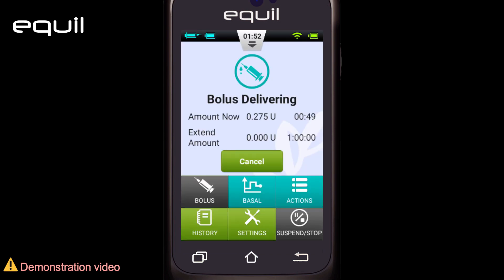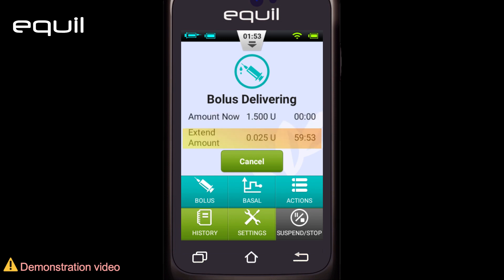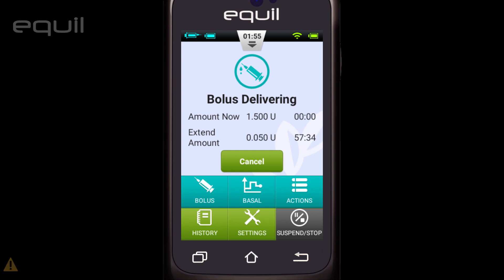While the pump is delivering, the PDA will revert to the home screen and display the extended bolus status and amount injected from both parts. A countdown timer shows how long is left to finish the remainder bolus portion.